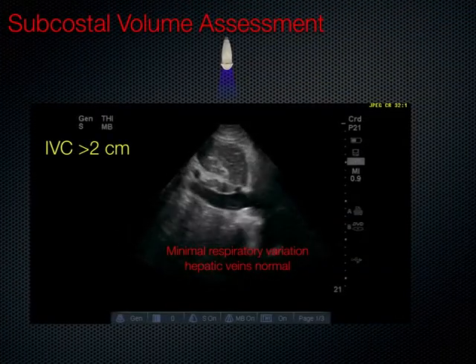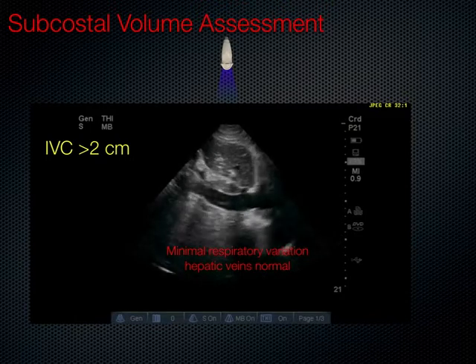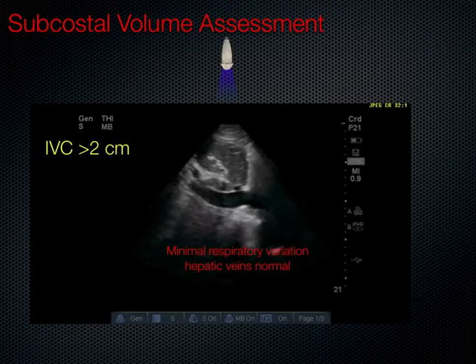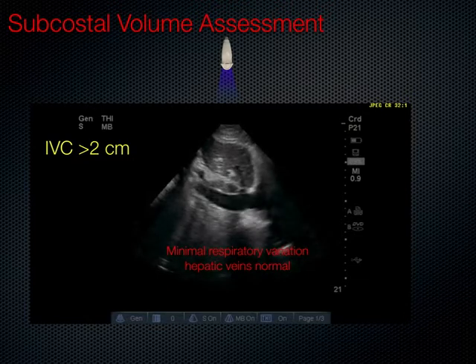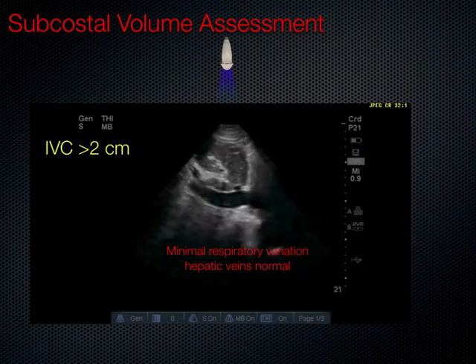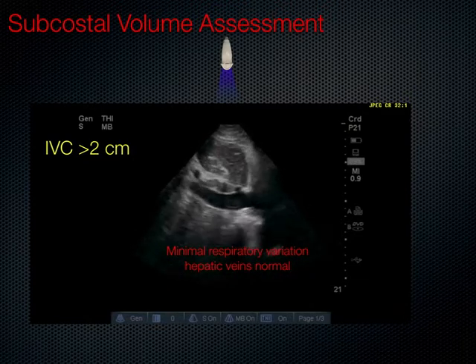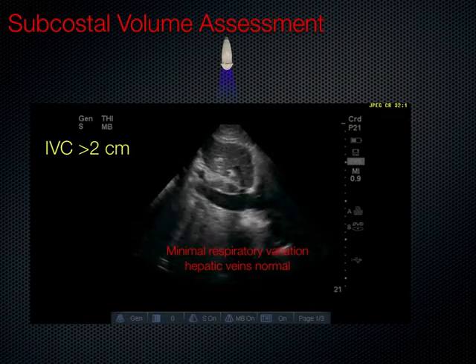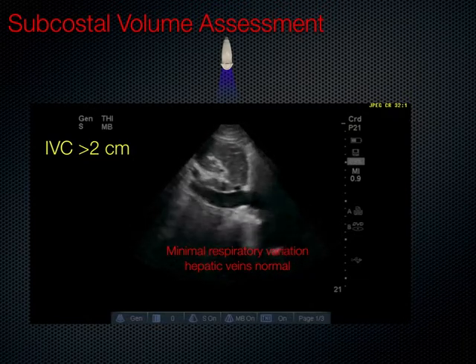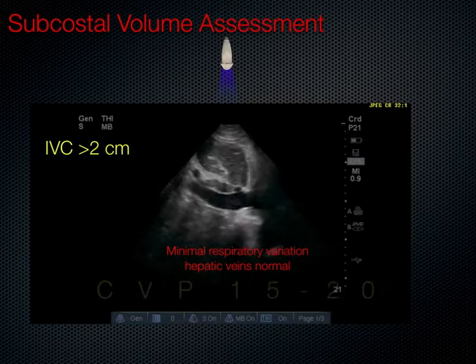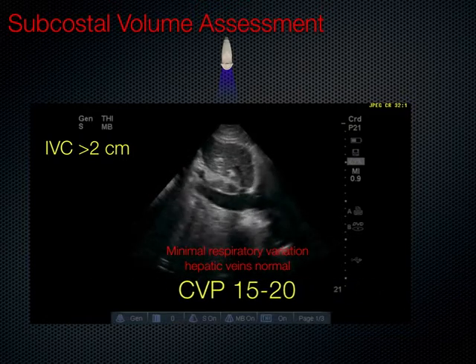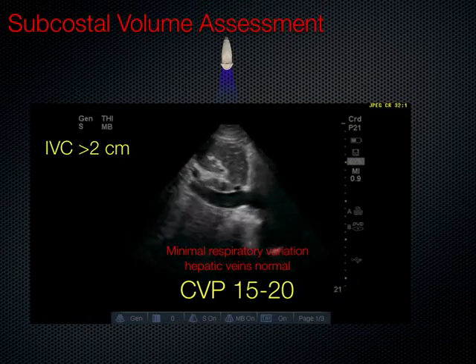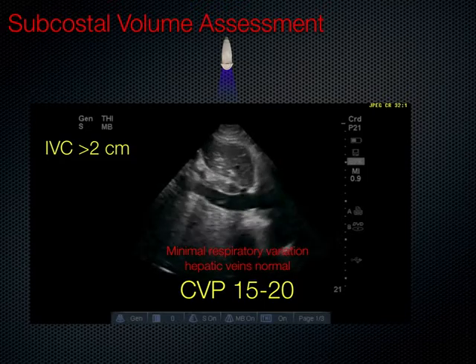From the subcostal view, we can also see the IVC appearing plethoric. Here you can see sluggish flow through the inferior vena cava with minimal respiratory variation, but the hepatic veins are not significantly dilated. Therefore, this represents a high-teens CVP.